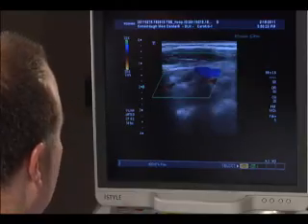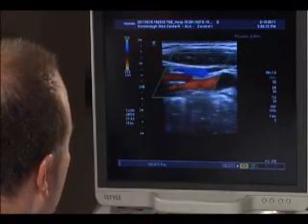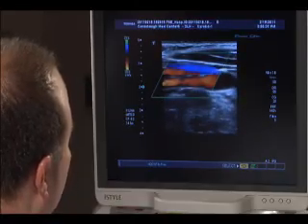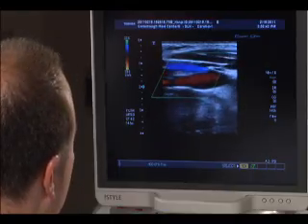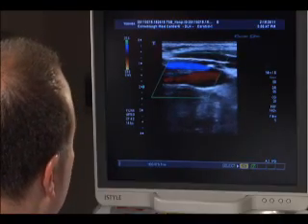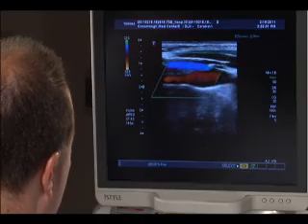But the official reading comes from the vascular surgeon after all of the study views are viewed once we get back to the lab after a screening. So people shouldn't expect to get any diagnosis or anything right there? No. What will happen is they'll be sent directly to the patient's home for our screenings. Abnormal findings will, in addition, be sent to the patient's physician.